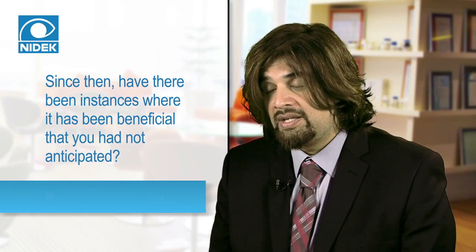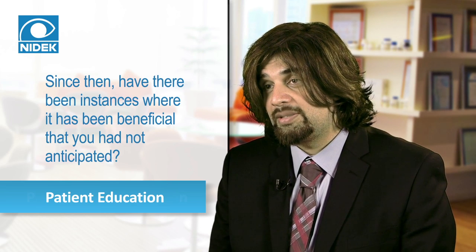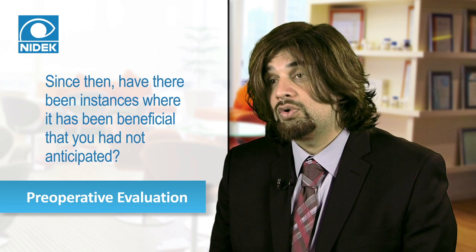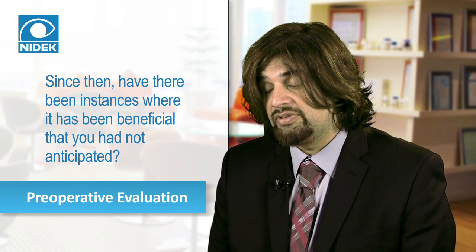We know that spherical aberration and other higher order aberrations can be concerns in certain IOLs. I think it's very important to preoperatively evaluate that before operating on a patient, number one, just to discuss potential concerns with the patient. And number two, in terms of selecting patients, we might want to avoid multifocal lenses, for example, in patients who have significant horizontal or vertical coma, or patients, for example, who have a significant amount of spherical aberration. So that certainly has been of value.